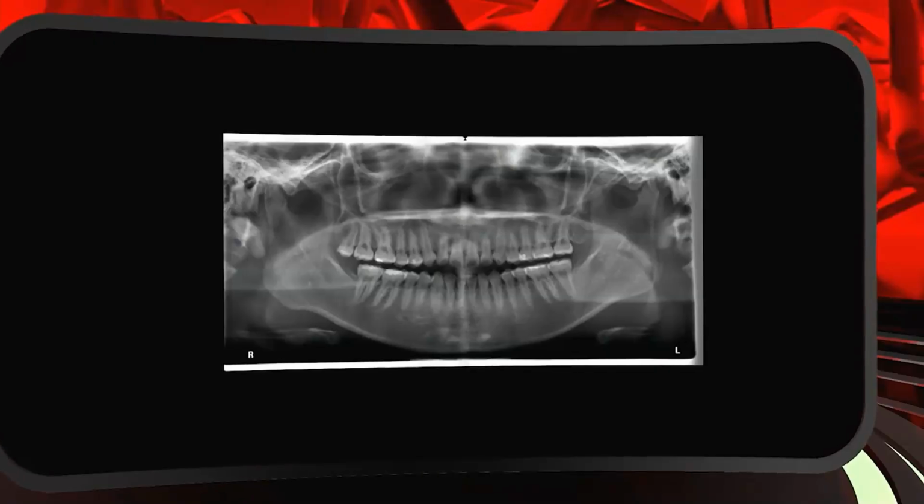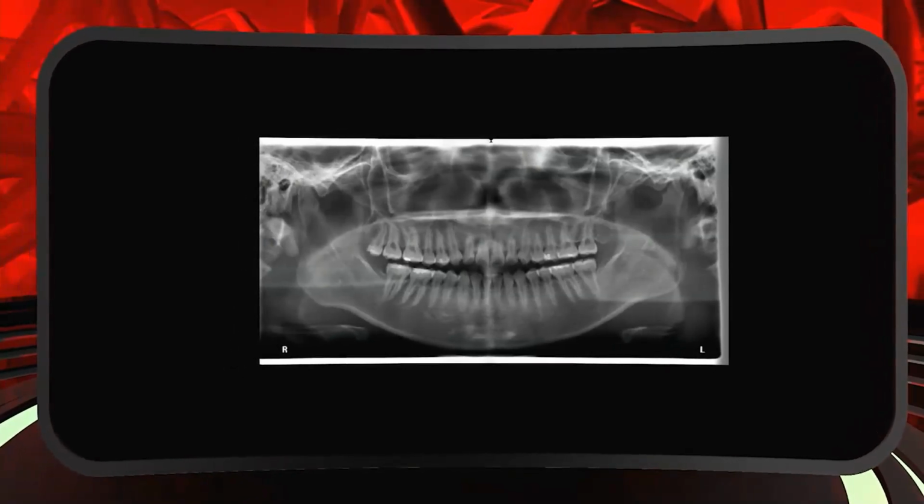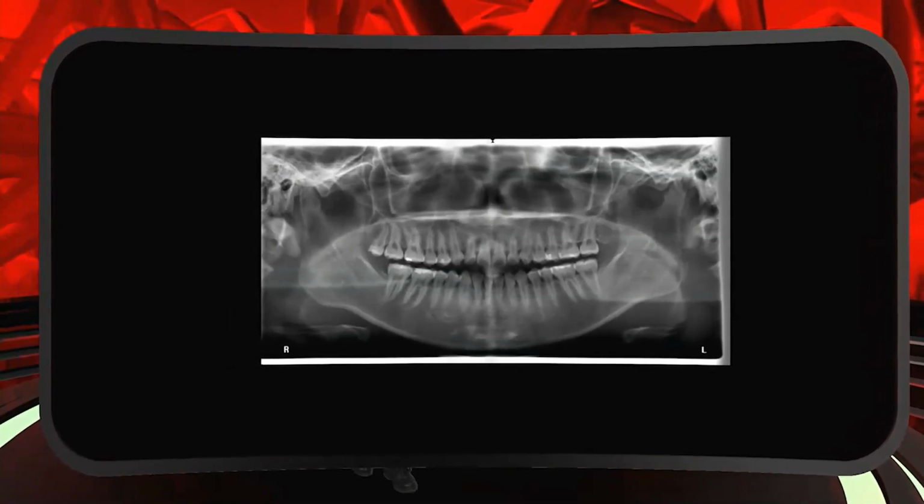Here it is the same. You could see that there is something wrong in the condyles. And actually here I see a bigger problem, and maybe the left one, I see that the surface is not even.